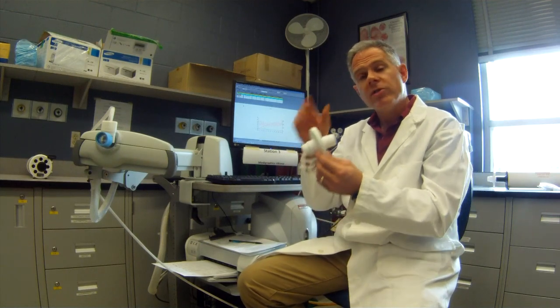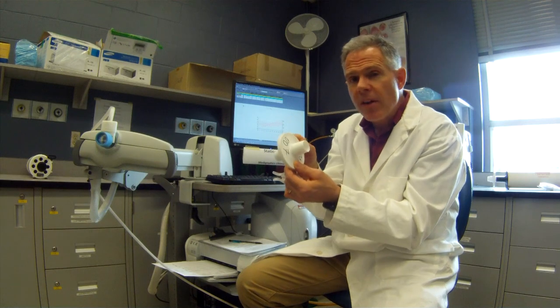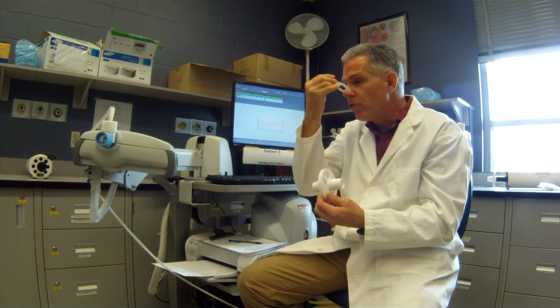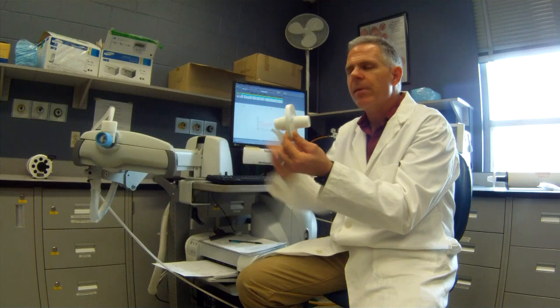So how do we coach the patient for this? Well, what we're gonna do, like we always do, is we're gonna get them to put the mouthpiece in, so they're breathing through this filter. We need to get their teeth around the outside, get a good seal with their lips. They're gonna be wearing their nose clips like usual, just because they're attractive. And to make sure all the air goes through the filter and the machine.